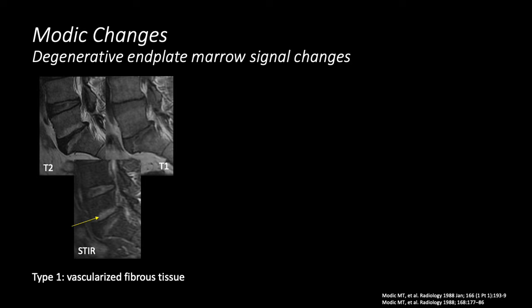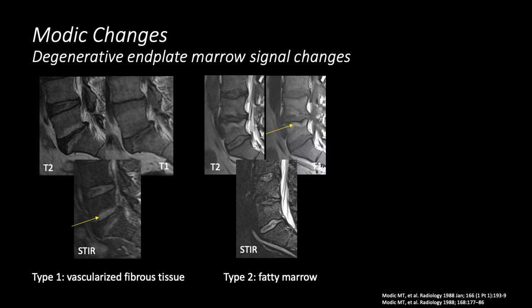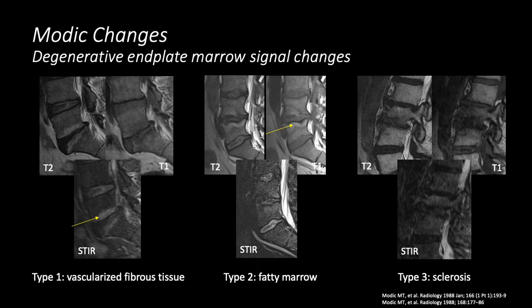The most common focal bone marrow abnormality we see, however, is benign. These are examples of Modic changes, which are degenerative endplate marrow signal changes. Type 1 is vascularized fibrous tissue, which has similar signal intensity to edema — bright on T2, dark on T1, and bright on STIR. Type 2 Modic changes involve fatty marrow replacement adjacent to the endplate. And Type 3 involves sclerosis, where the signal intensity of the endplates decreases on all sequences.